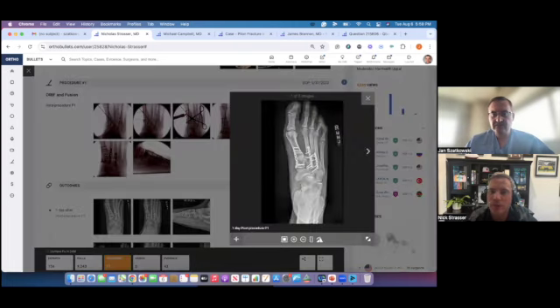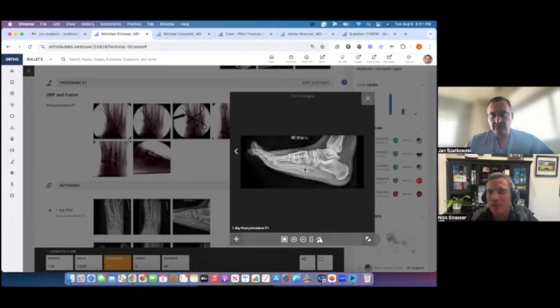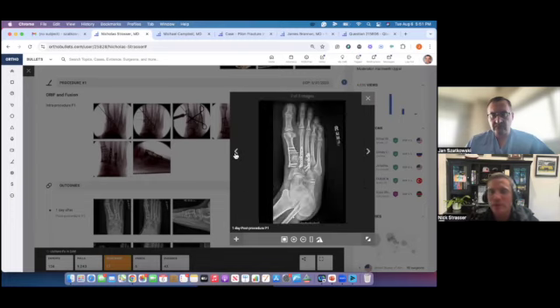I would say this from a couple of years ago. One thing I have started doing more and more is if I get the first bridge plated, sometimes I'll use 90/90 plating, and then I'll get the third oftentimes plated because I usually have direct visualization at that level. And then it can be a little bit difficult, with where I put my incisions, to get to the second cleanly, and it feels like you're stripping a lot. So in some of those cases, once I've got the first and third, then I'll just put compression screws, maybe across the Lisfranc joint and across the second TMT joint. And that works pretty nicely because you're working in that trajectory anyway with where the incision is. And then I don't have to worry about exposing the second metatarsal. You've got the neurovascular bundle right on the top of that area usually. And it's just a little less hardware to manage as well.